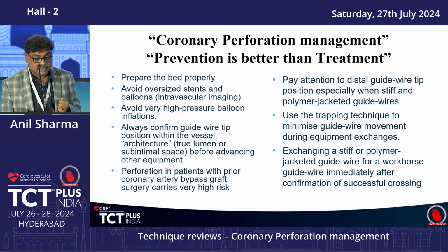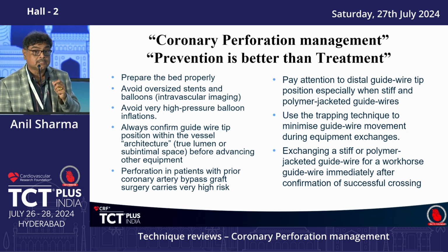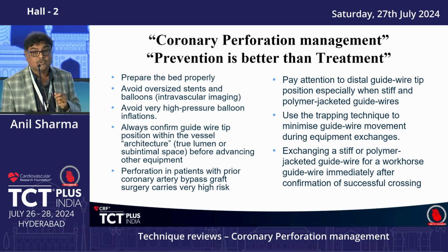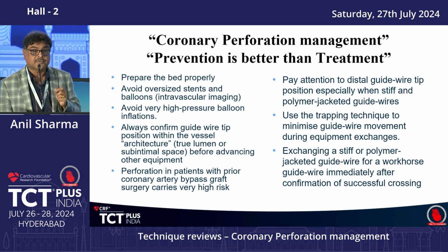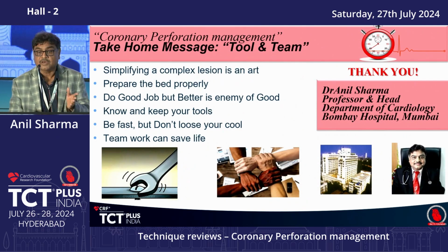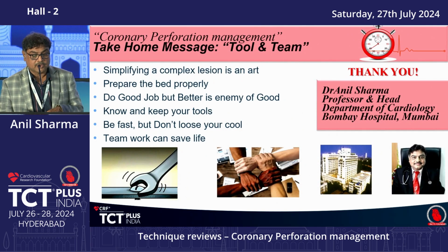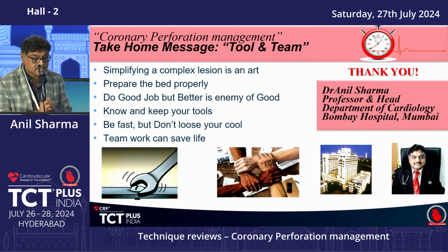Prepare the bed properly. Avoid oversized stent. Always look for the guide for the distal tip, particularly with the hard wires, particularly those are the jacketed, polymer jacketed wires, all these things. And once the difficult wire is made to cross the difficult lesion, it has finished, exchange to the normal, your workhorse wires. So take home message, tool and team, T&T.